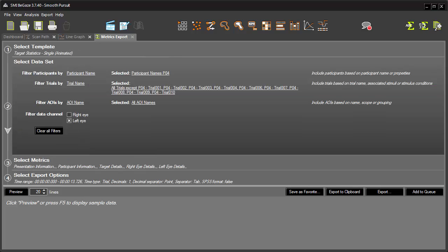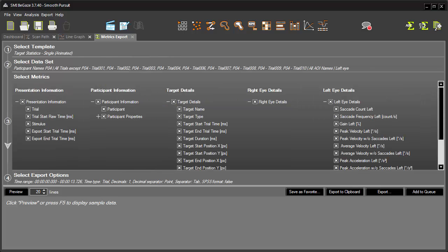Under Select Data Set, you can easily define the datasets you are interested in. Now, I can move to Select Metrics, where the full spectrum of metrics is available, including many specific for saccadic and smooth pursuit paradigms.